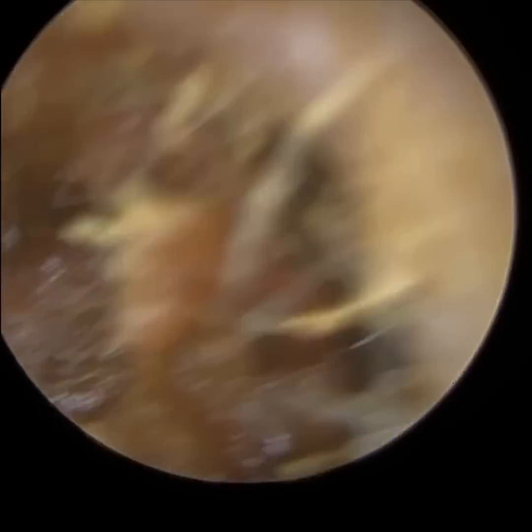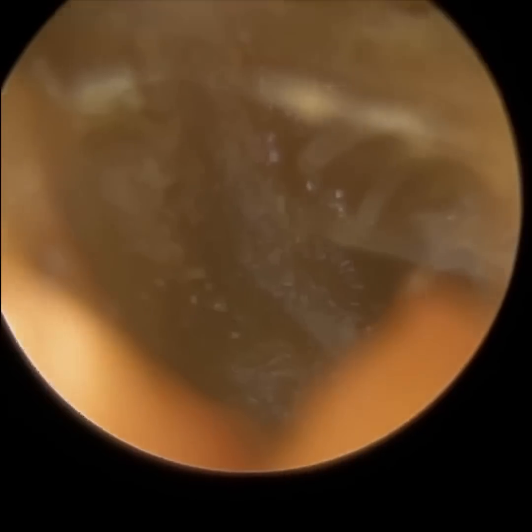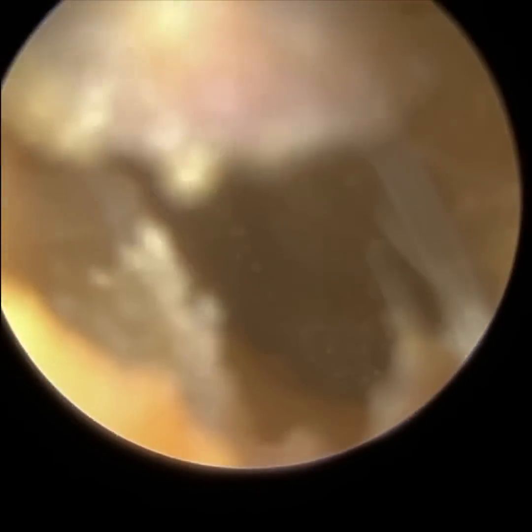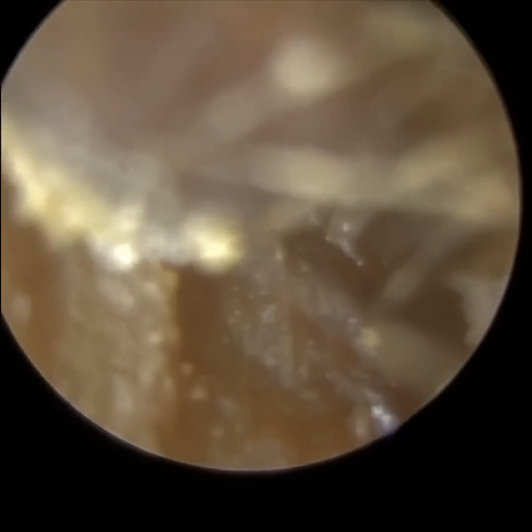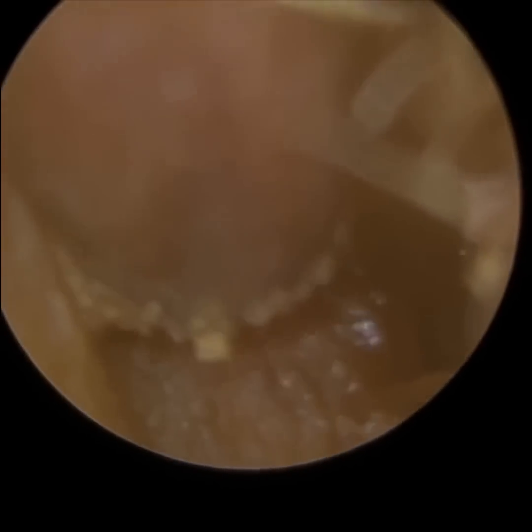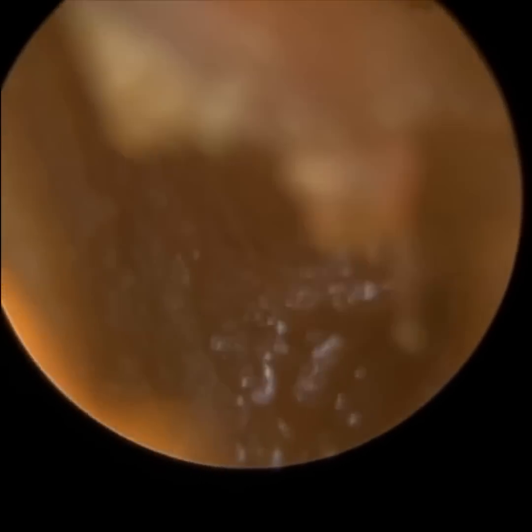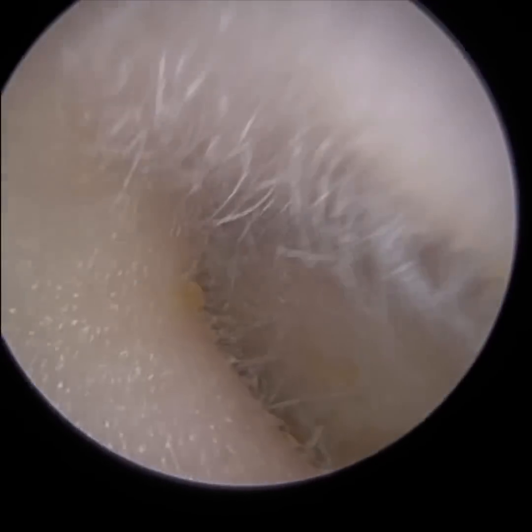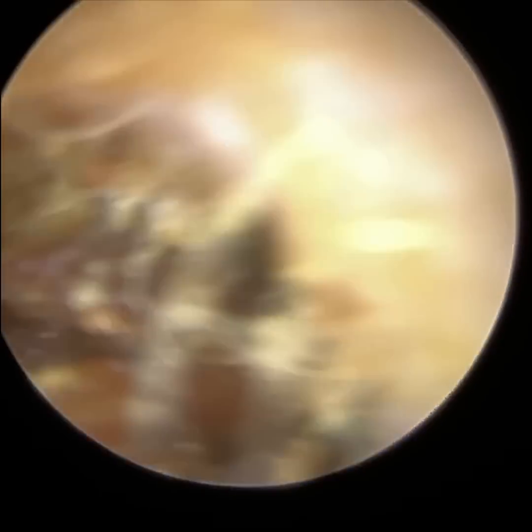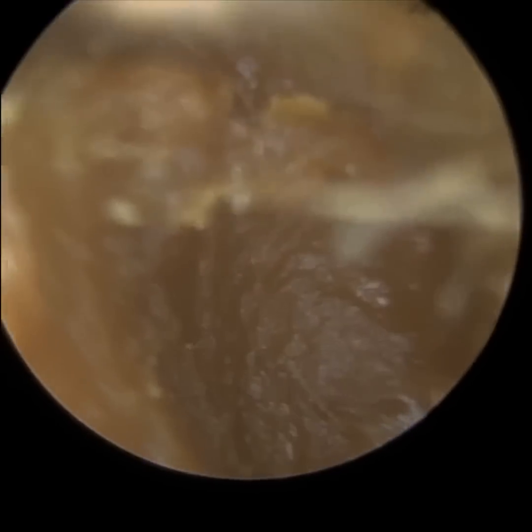Especially in cases like this where I'm having to stretch the ear canal open. I'm actually using the endoscope to stretch the ear open because the ear canal entrance is very narrow, and the only way I can do that is to put the endoscope in the ear. And obviously I need to put the endoscope in the ear anyway to remove the wax. So I can't really help the location of the wax. If the wax is near the entrance, then of course it's going to be close up to the tip of the endoscope. And as we start clearing the wax away from the entrance, then you'll see the wax is further away.